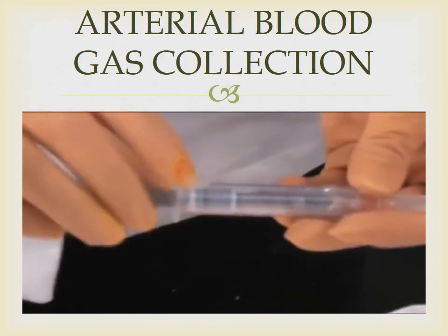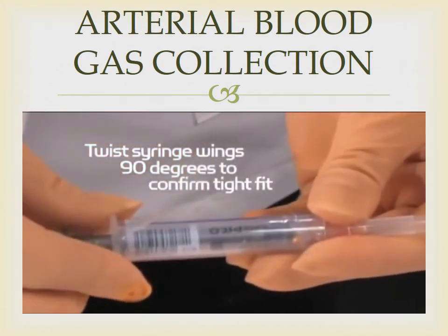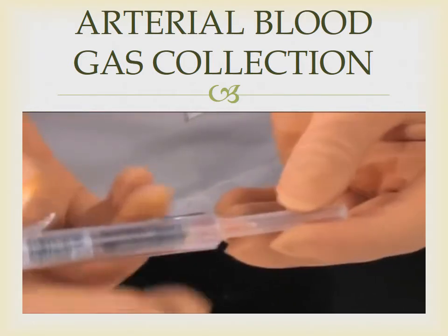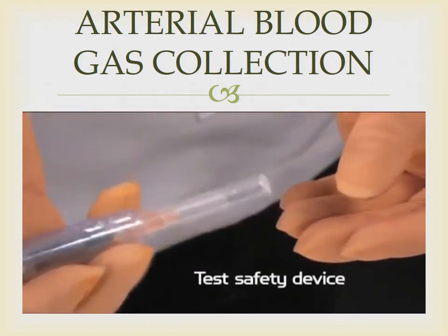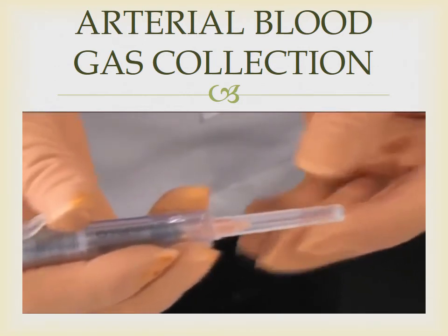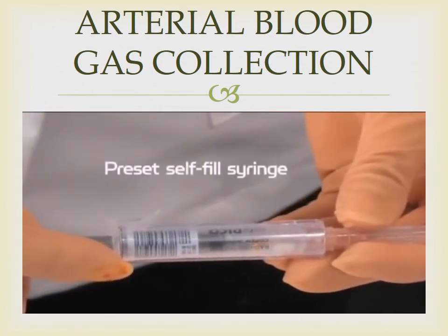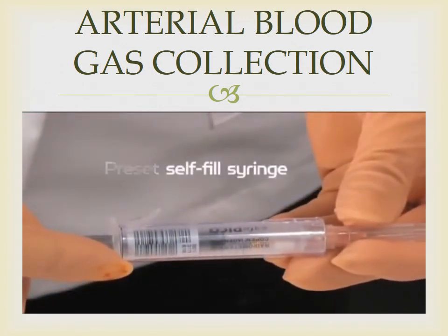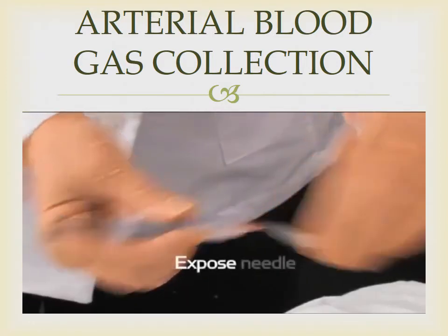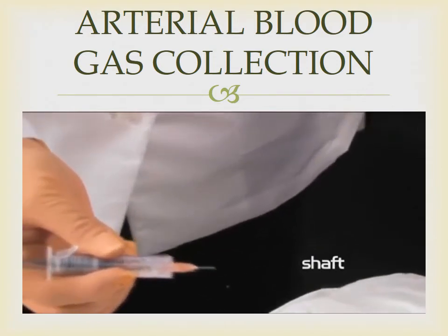Twist the syringe wings 90 degrees to confirm a tight fit between the syringe and the safety device. Test to make sure the safety device moves easily. Preset the self-fill syringe to the desired fill level by drawing the plunger back to the desired mark on the syringe. Expose the needle shaft by holding the barrel with one hand and pulling the needle sheath straight off without twisting with your other hand.